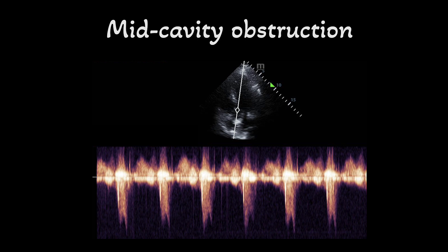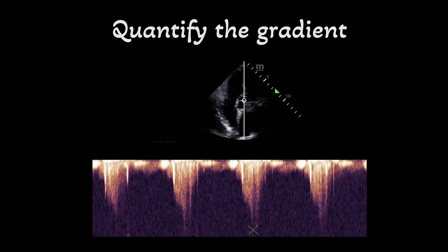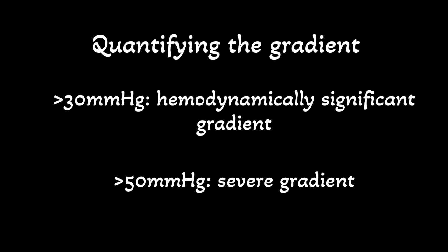You see a rabbit-ear pattern on continuous wave Doppler in mid-cavity obstruction. To quantify the gradient, measure the peak systolic velocity of the curve; the ultrasound machine will automatically calculate the gradient using Bernoulli's equation. In this case, the gradient was 36 mmHg. A gradient more than 30 mmHg is considered hemodynamically significant, while more than 50 is considered severe. However, do not ignore gradients less than 30 — like tamponade, LVOTO and mid-cavity obstruction exist on a spectrum. A gradient less than 30 with other manifestations such as worsening shock, SAM, and MR in the presence of a substrate is important enough to require treatment.